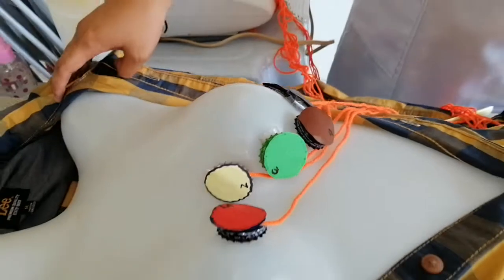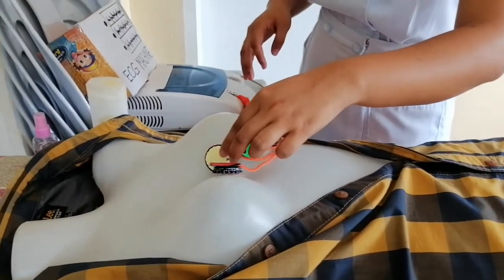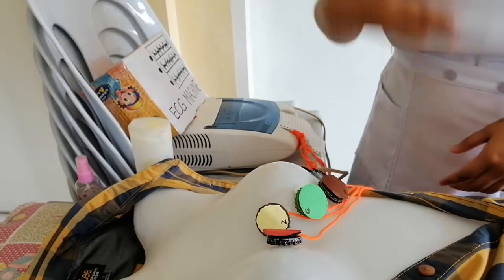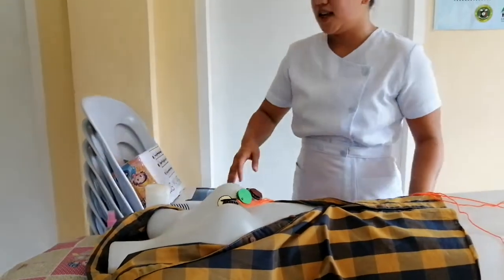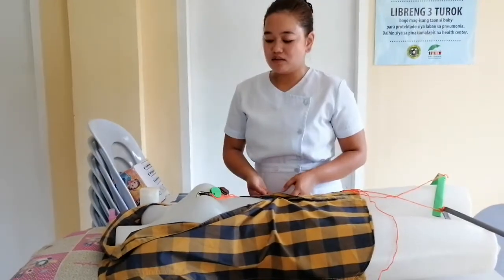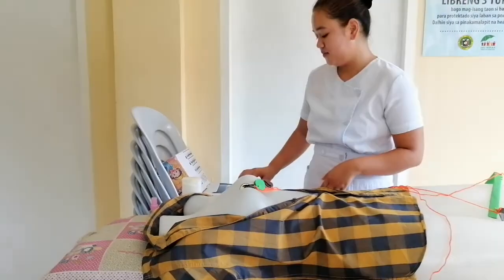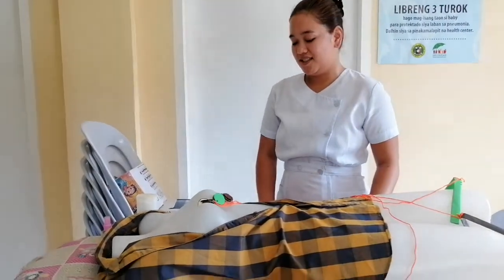And so everything is set and placed already in the proper position. Then we're now going to let the ECG machine obtain information about the heart of the client. So let's wait for the result to come out of the ECG machine. Wait for a few minutes.